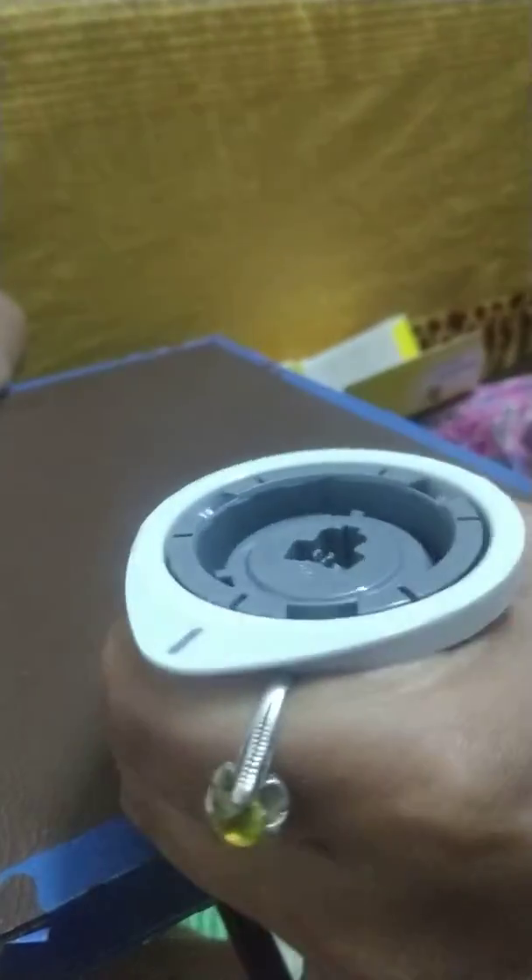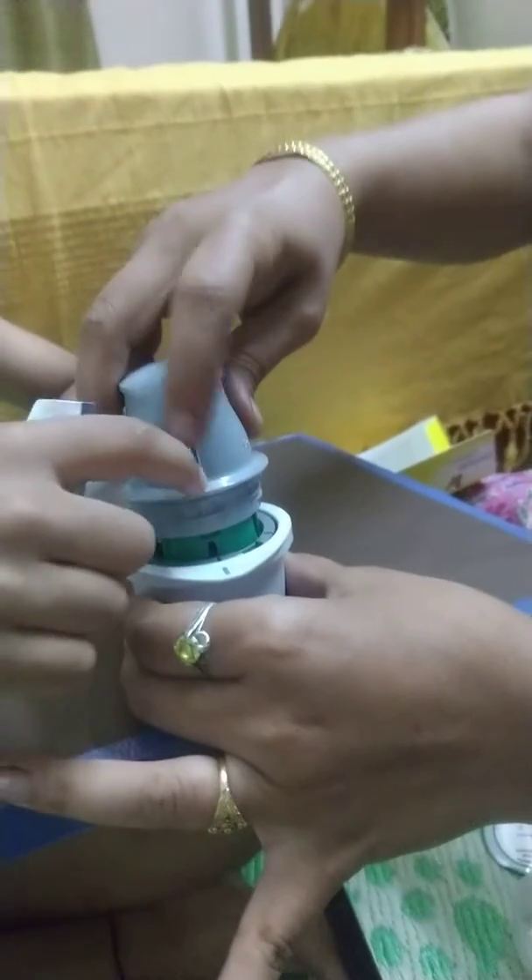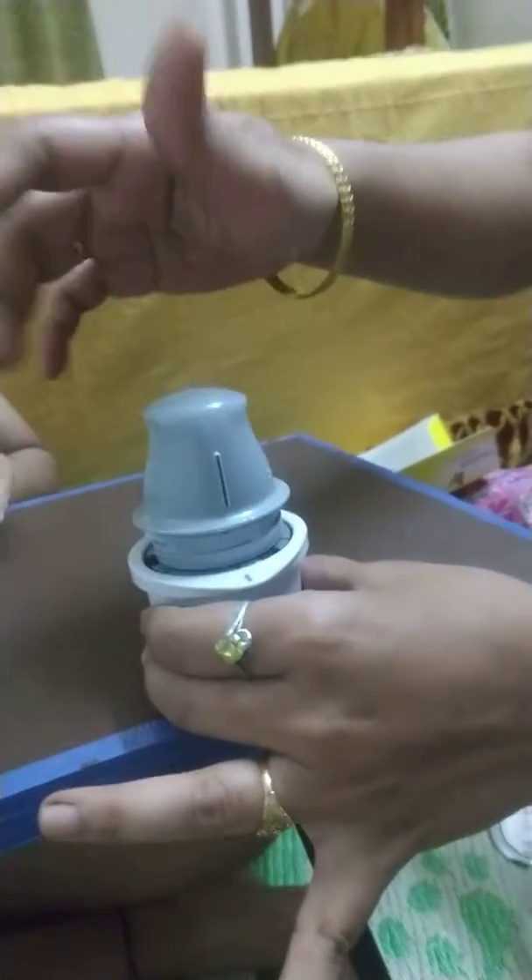Now my mother is opening. Now she is putting further. Now she is doing step 3. We should put this line to this, so be careful for this step.